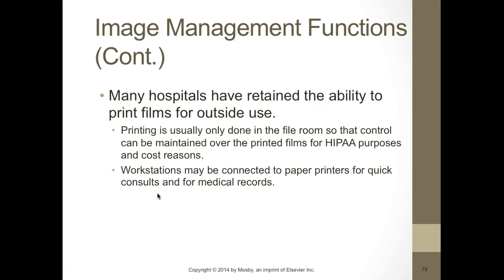Hospitals have to retain the ability to print films for outside use. A lot of hospitals are getting away from printing the films.